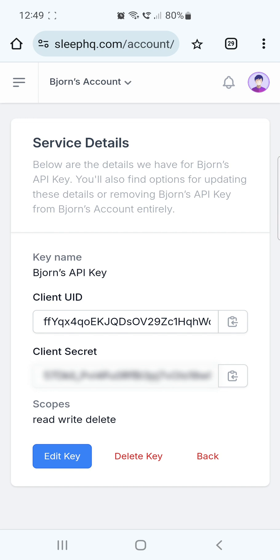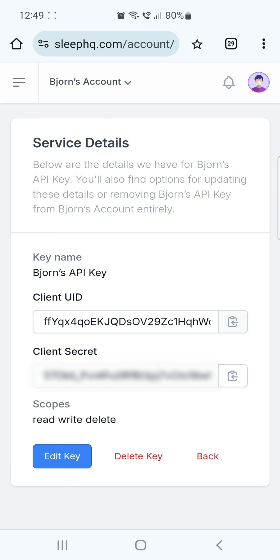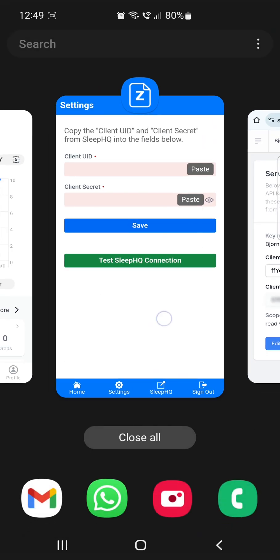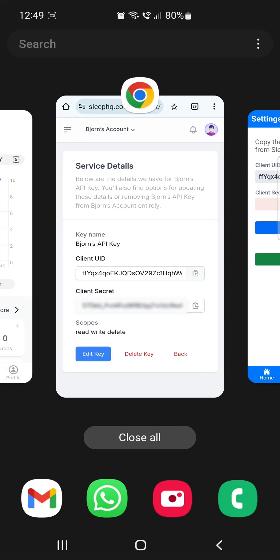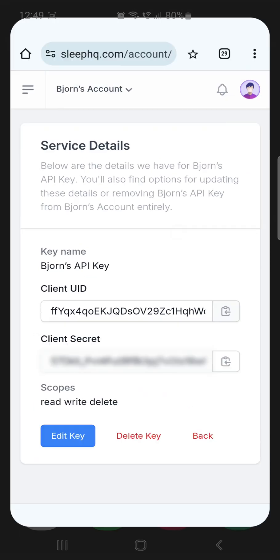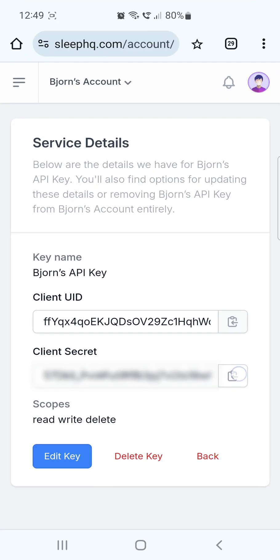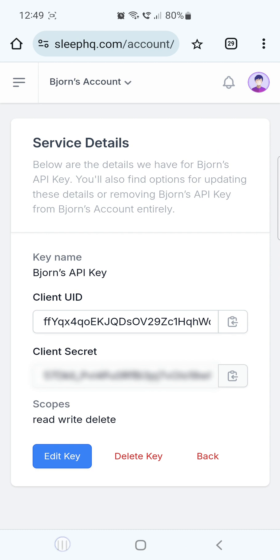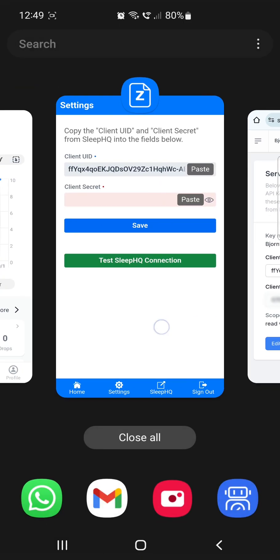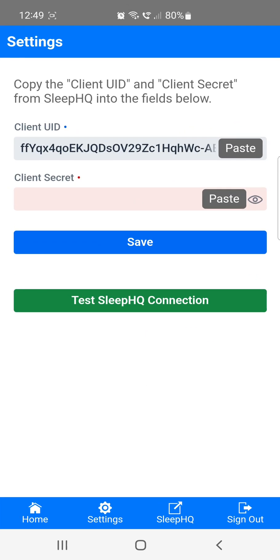Next, tap the Copy button next to the client ID. Now, switch back to the Sleep Data app and press the Paste button in the Client ID field. Then, go back to Sleep HQ, tap the Copy button next to the Client Secret, switch back to the Sleep Data app again, and paste it into the Client Secret field.